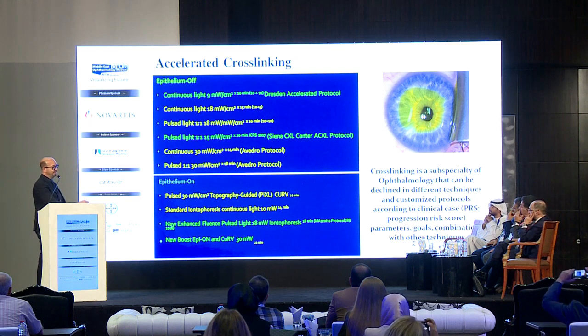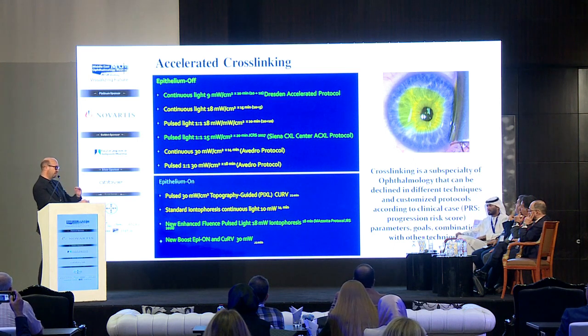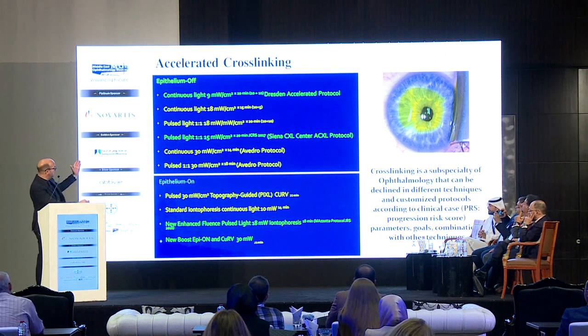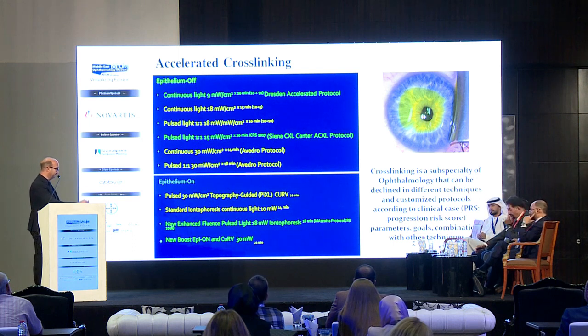Take a look here. We have a lot of protocols now. So cross-linking today is a subspecialty. We can use it in different ways according to the clinical case. So we can customize cross-linking, and we can combine cross-linking with different techniques. You can see the 9 milliwatt that replaced the Dresden protocol now in Europe. Not in the United States, where only the Dresden protocol at 3 milliwatt is approved.